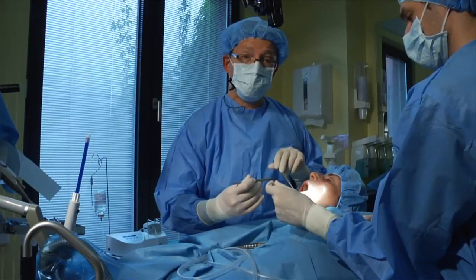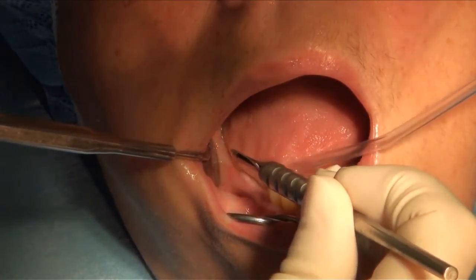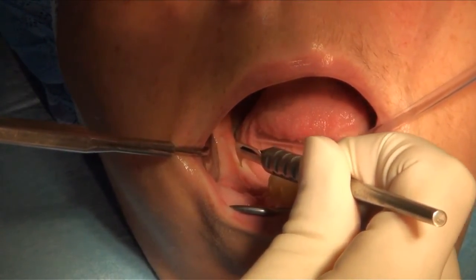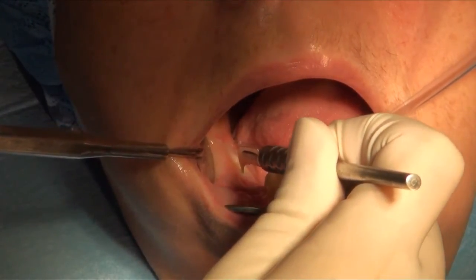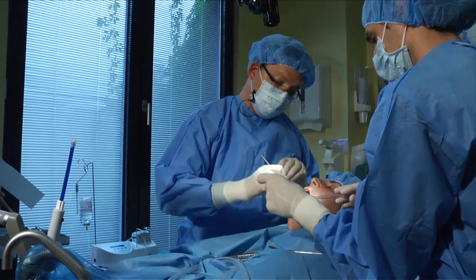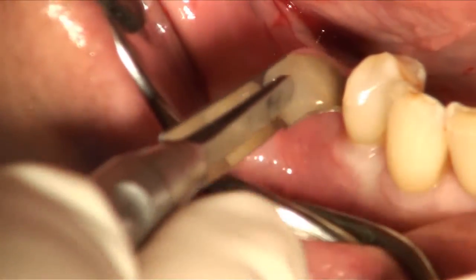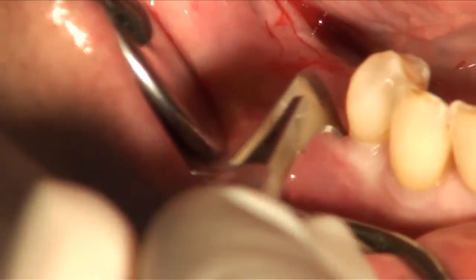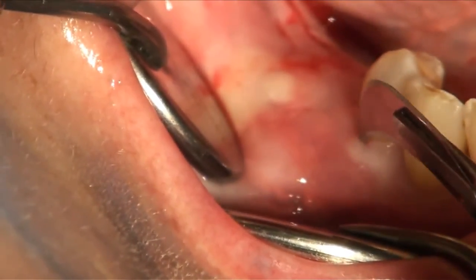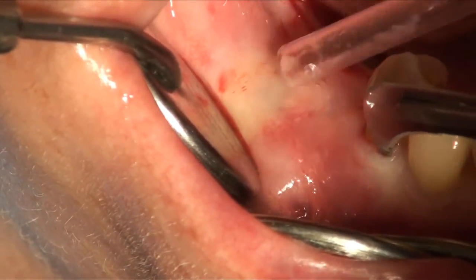Okay, our first incision goes in the middle of the crest, mid-crestally, within the keratinized tissues. We will stay a little bit aside from the position of our expander in this soft tissue. So we put the mid-crestal incision within the keratinized tissues, and now the sulcular incision around the anterior tooth, adjacent to the dentulous area. And in front of this next tooth I will put the releasing incision.